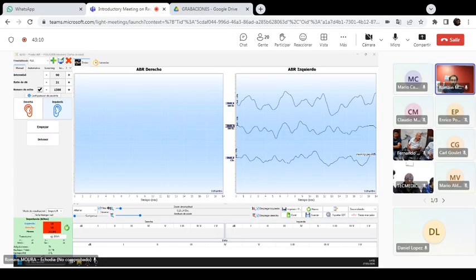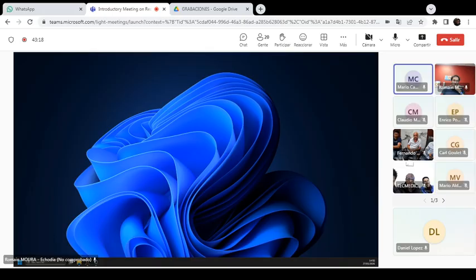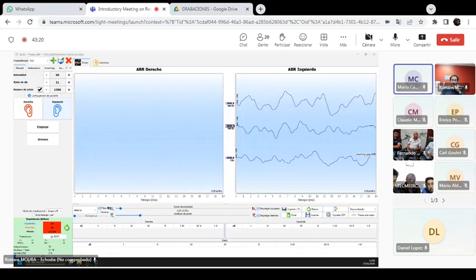Yeah. Yeah, so please, I think a request from our side: can you please double check if the bone conductor was part of the standard accessories? We can also do it on our side, but maybe it's better that you check. Yes, I asked one of my colleagues to check what was in the order. So yeah, I will tell you quickly.